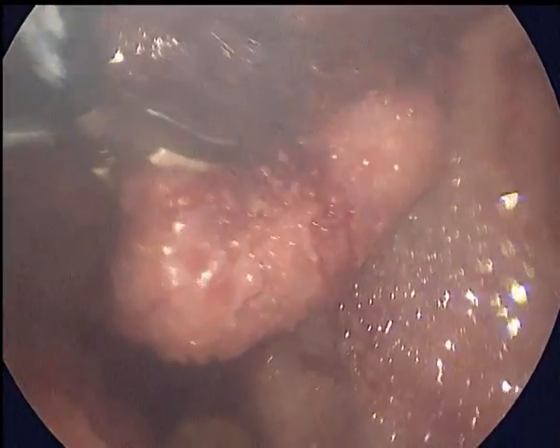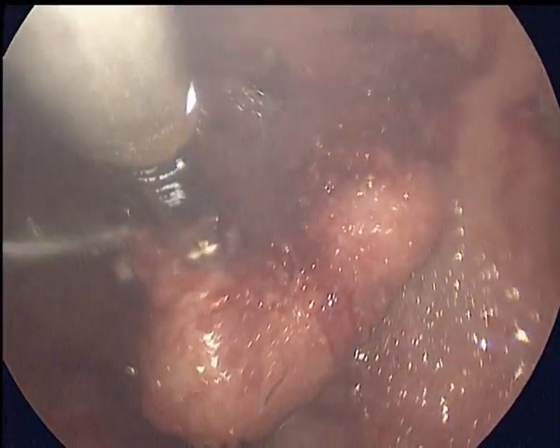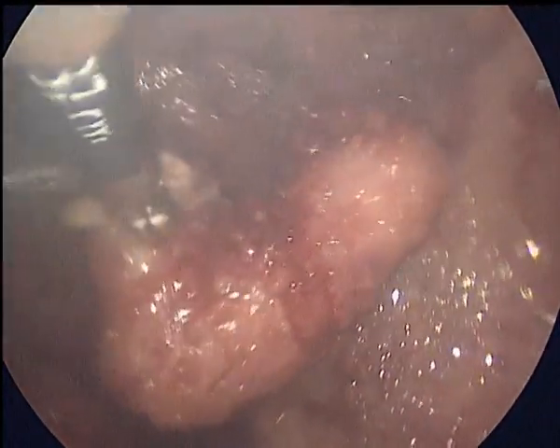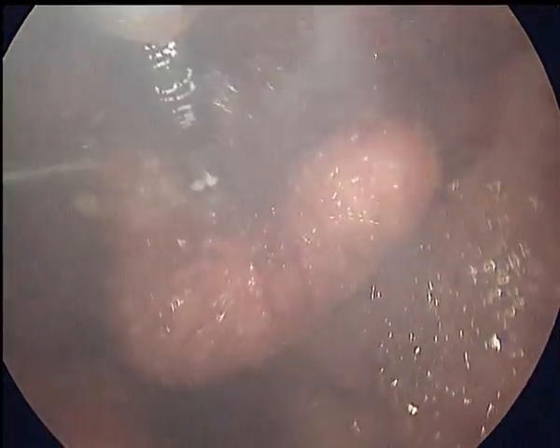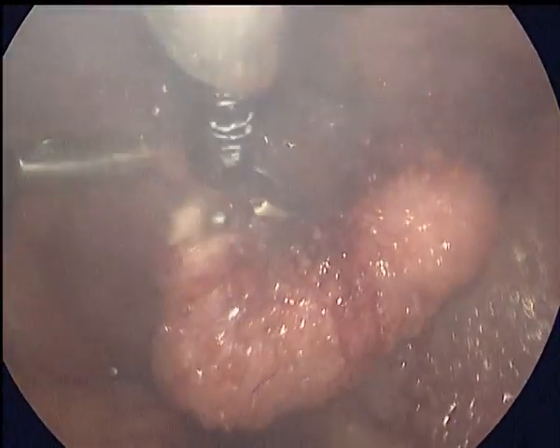So we thought in our OT it is a case of advanced ovarian malignancy, but surprisingly it came to be tuberculosis. That is good for the patient. So this is the last part of the fallopian tube biopsy.